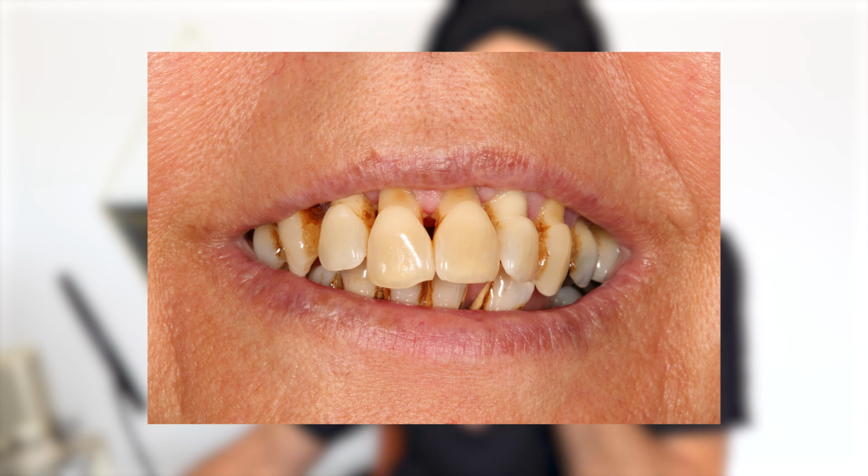Now here they look too long, and we have to decide, okay, are the teeth too long or has the gum shrunk up too much? So the incisal edge, which is the bottom edge of the front teeth, needs to be in exactly the right position, or as close as we can for the temporaries. Because at the end of the day, it's a bit of a guess.